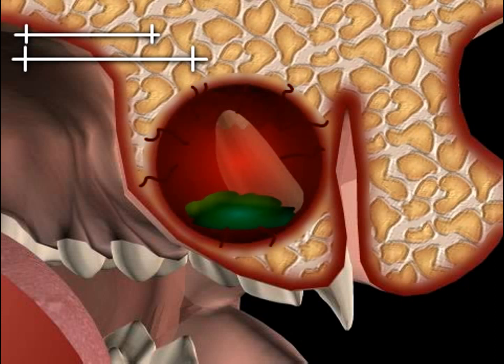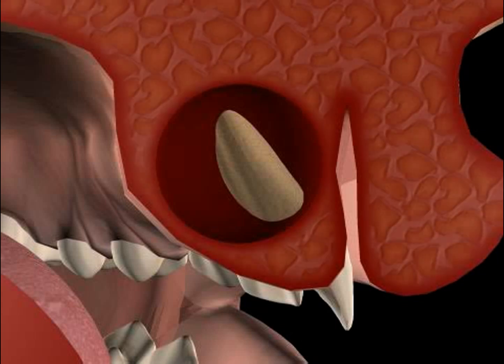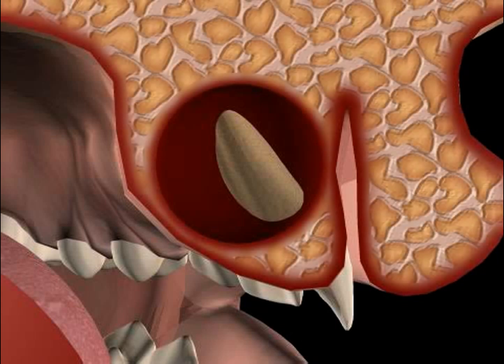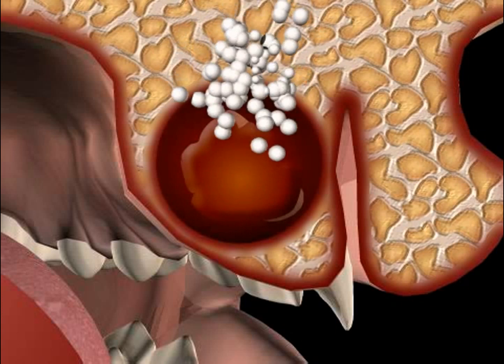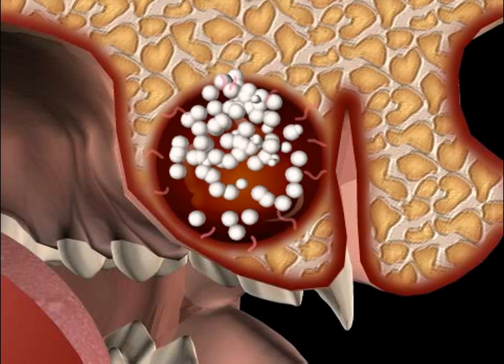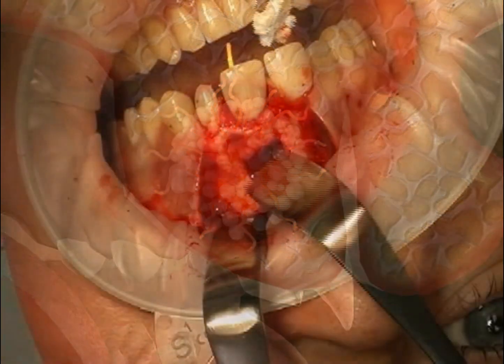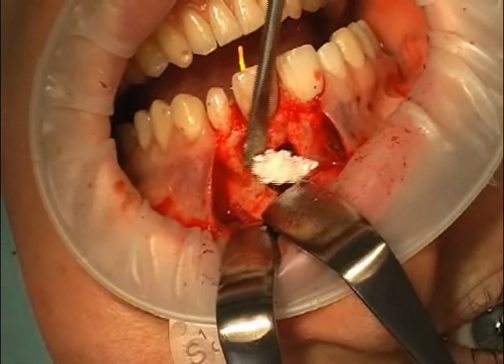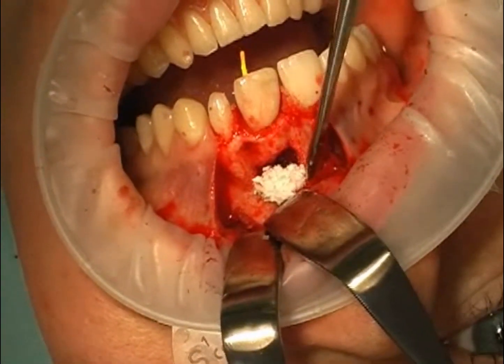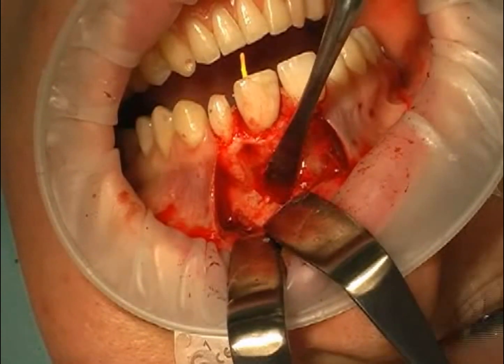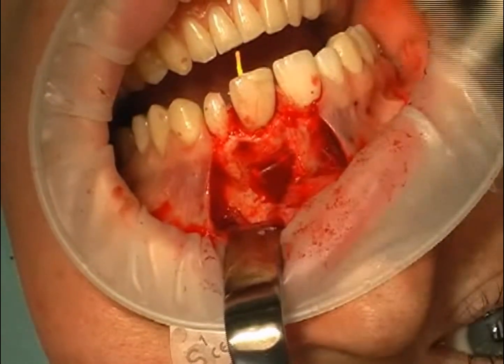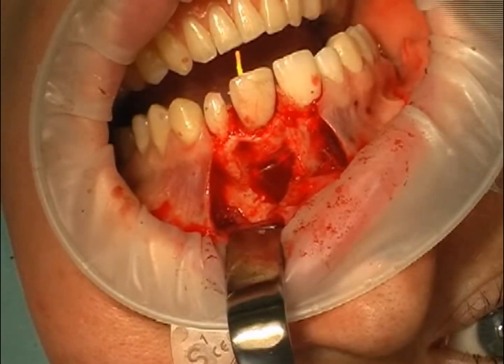In order to avoid this complication in the case of large cysts, it's common to try and stabilize the coagulated blood and to reduce its contraction — for example by filling the hole in the bone with a granulate made up of bone replacement material, as can be seen here. In this way a contraction of the clot is inhibited, blood vessels can grow in from the walls, and the foundation has been laid for the subsequent regeneration of the bone.